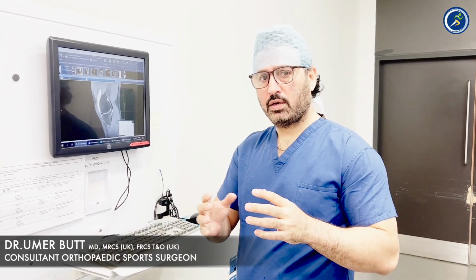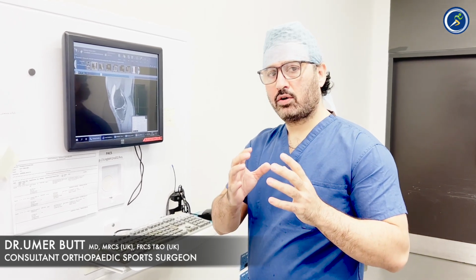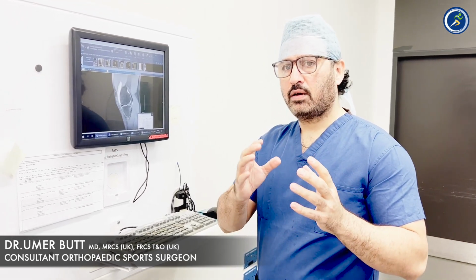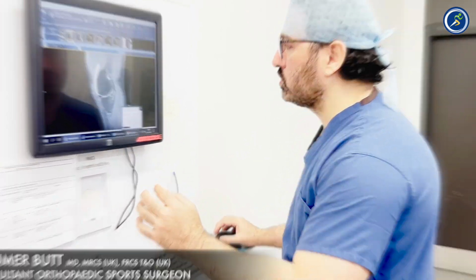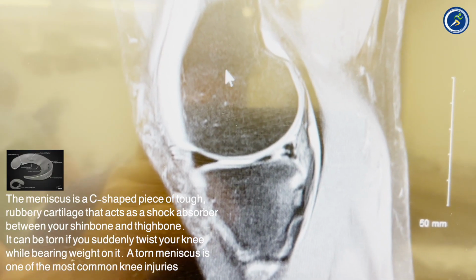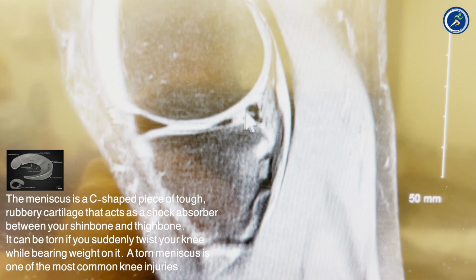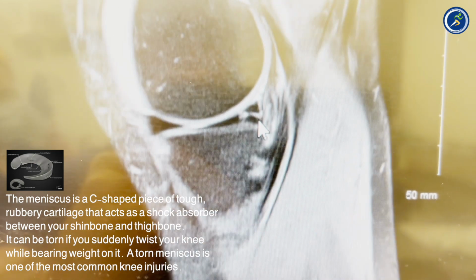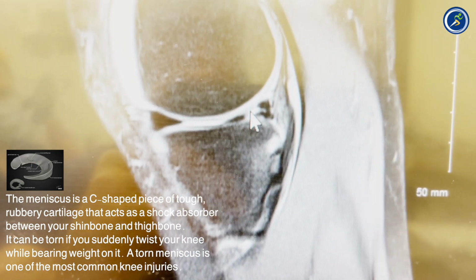Okay, so good morning. Today we are doing a surgery in Sulis Hospital, and I want to show you a young guy who had a complex meniscal tear, and how a complex meniscal tear looks on MRI scan. If you can kindly come close, it's so important that on a surgical scan, if you look, this is a normal articular cartilage, this is normal articular cartilage, this is a normal meniscus, and you can see how complex one tear is going here, one tear is going here.